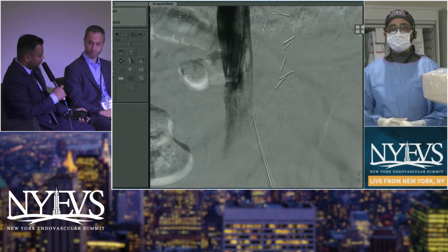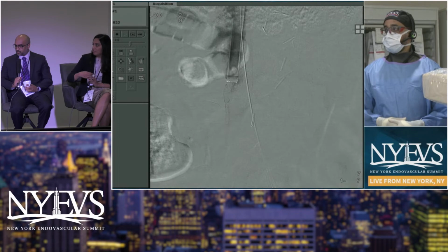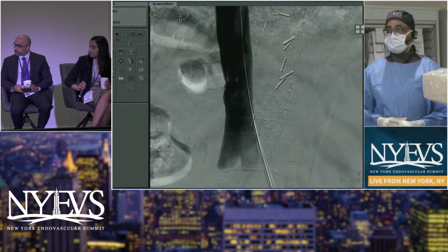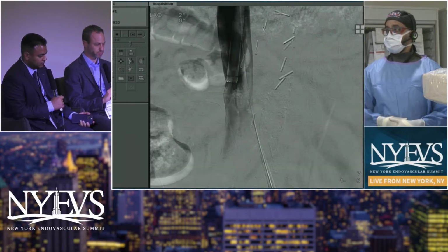What are you guys doing? I've used an aortic occlusion balloon. I've never placed a stent graft. I don't know if any of you guys have. We've done it a couple times, but usually place a wall stent, if anything at all. Usually you can get it to stabilize with balloon and prolonged inflation.